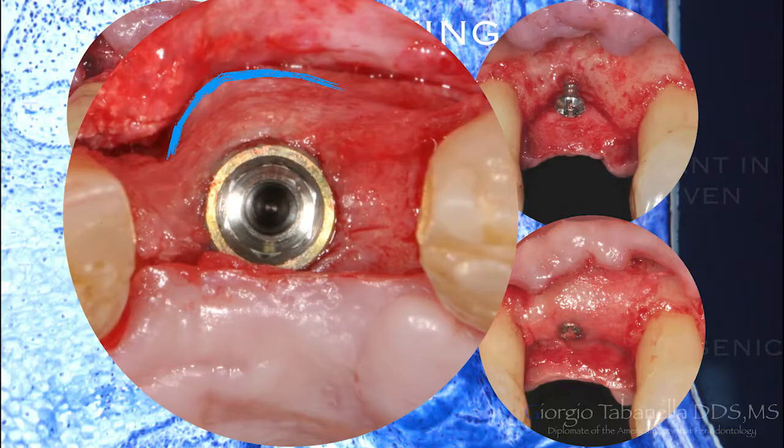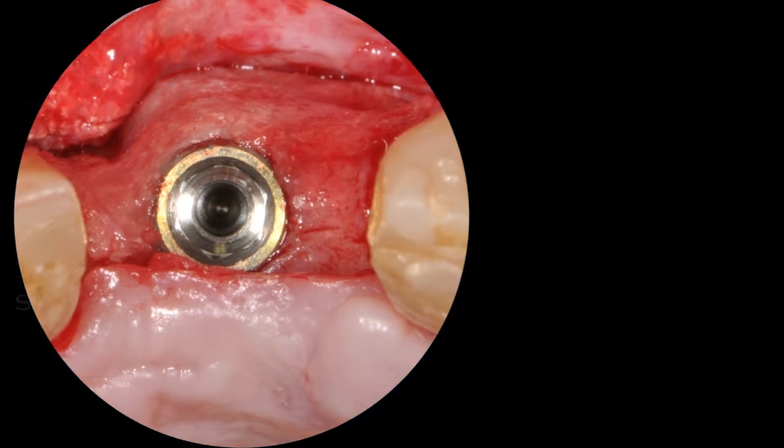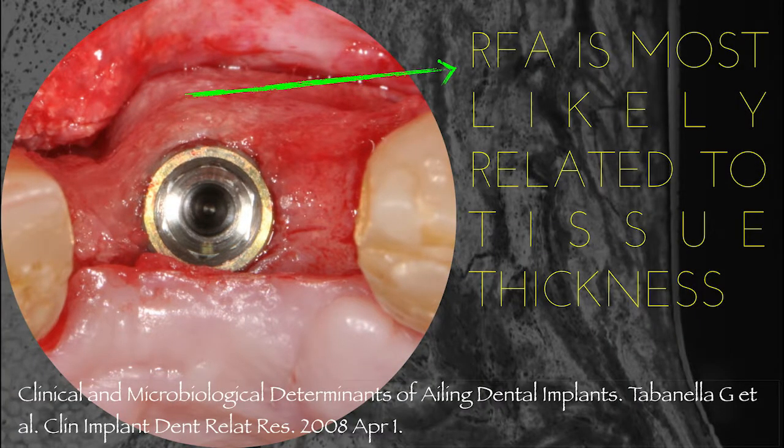But then it's very important also to have enough bony structure, not only for implant placement to get the primary stability, but also to create what is called the buccal bone balcony. This buccal bone balcony is going to support also the soft tissue. It's going to change the appearance also of the soft tissue. And this is very, very important. And we have seen that this thickness is most likely related also to the RFA measurements.